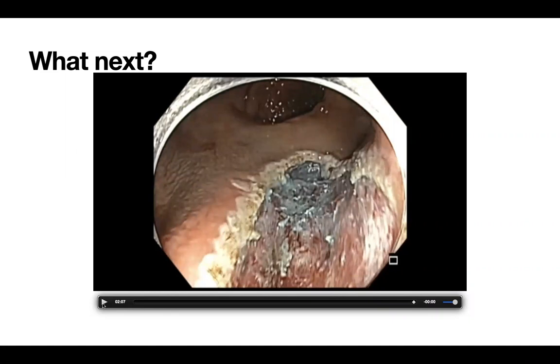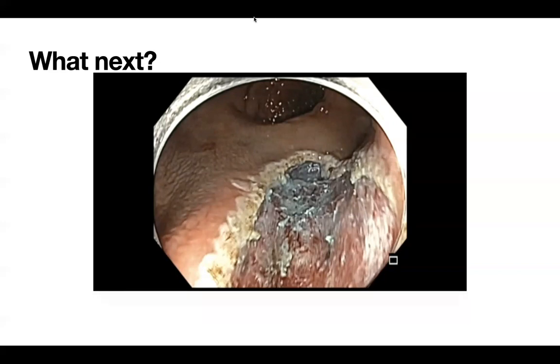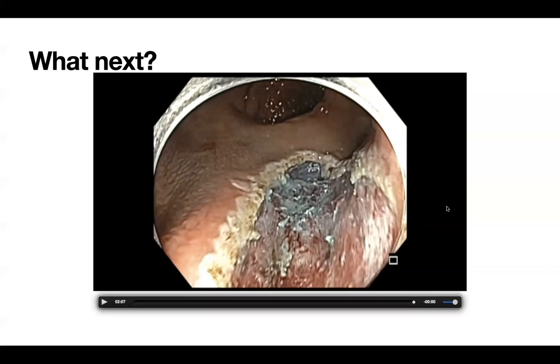Selvi? I'm a little scared about the anorectal region, maybe because I'm not comfortable dealing with the anus and the pain and the telephone calls later. So I generally try to stay away from the dentate line. That is the reason for my comment earlier about the difficulty. But I also see this case as a learning point from another perspective.